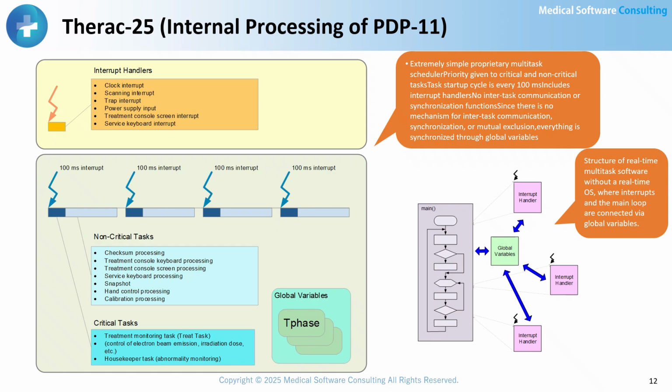By contrast, the basic principle of modern object-oriented design is to build each software component with high cohesion and loose coupling. In other words, each component's responsibility should be clearly defined, with no overlaps, and the connections between components kept as weak as possible. This increases the independence of each component, makes it easier to identify the faulty component when a defect occurs, and also makes it easier to verify components individually.